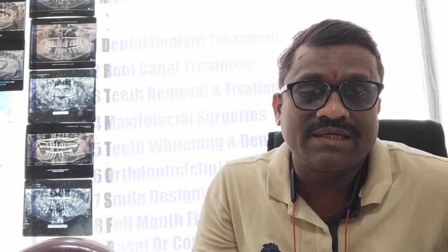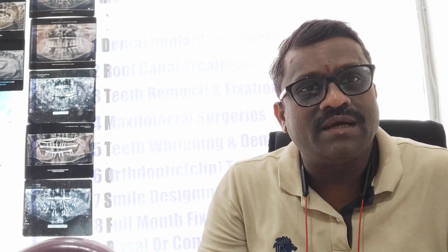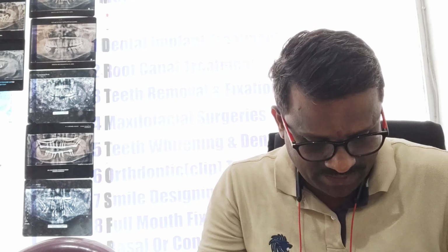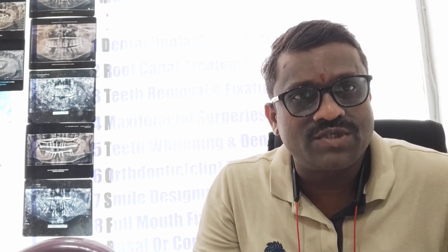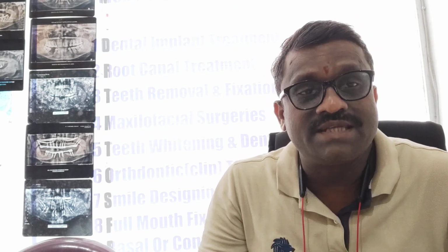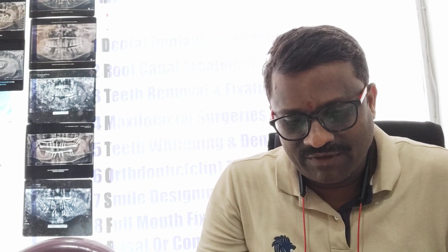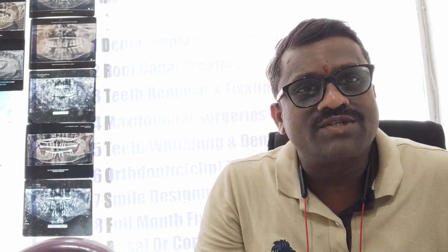It has stoppers. Stoppers means that if the length you are supposed to drill is up to 18 or 20, there will be a stopper at that end. You cannot drill beyond that, so you will not go beyond whatever length you want to drill. It will minimize any defect that could happen. If you want to drill more, you cannot, because of the stopper. It will stop wherever it is desired. So we use different kinds of drills in the conventional technique.